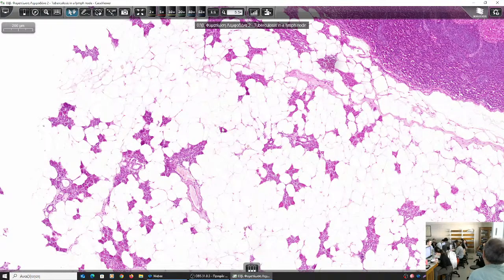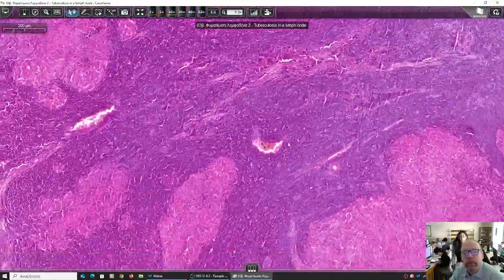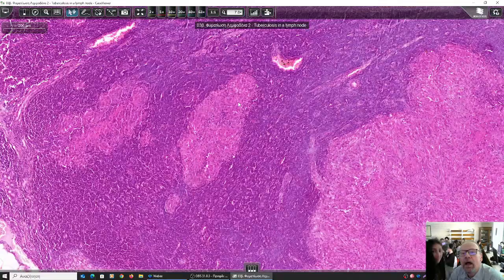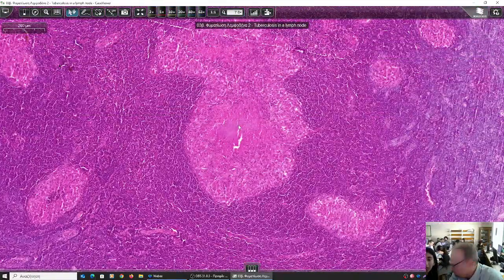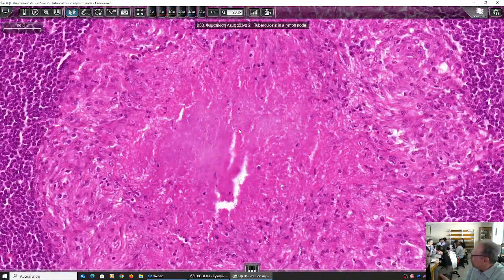Yes, please. Come here, please. Come and sit here. So, have a look at this granuloma. You see, these are only epithelioid histiocytes. Okay. Have a look at this one. You see this area here? It's some sort of, you see, it has no structure. Here we see the epithelioid histiocytes that form the immune granulomas. In this area, we do not see it. Okay. So this is caseous necrosis.